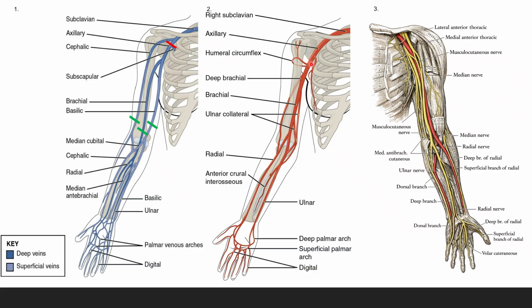So then you're the arteries, axillary artery, pretty deep, shouldn't be sticking near here. But kind of in this territory, you have a lot of different collateral branching arteries. Main big red, we're going to avoid brachial artery. Then we got our median nerve alongside the brachial artery. If you get past the antecubital fossa, might go from that round ovoid shape to more like triangular shape. But don't want to stick either of those.